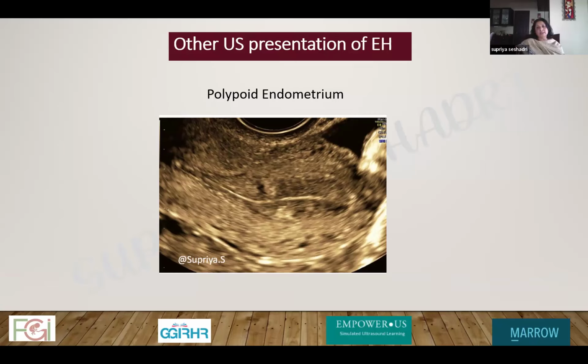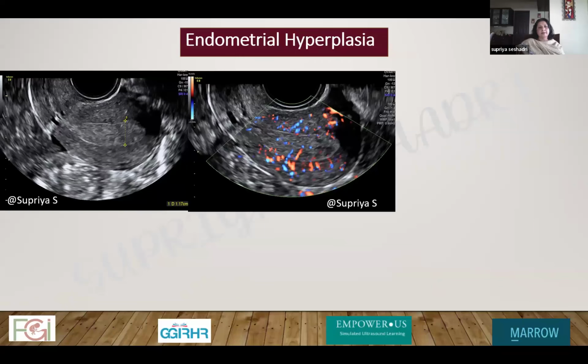And therefore, before just dismissing it as a secretory phase endometrium, one would think that there would be a role for endometrial biopsy in such cases. When there is endometrial hyperplasia, like this, which is again polypoidal, and we see these multiple vessels crossing the EMJ, entering the endometrium, what is called multiple vessels, multifocal origin.